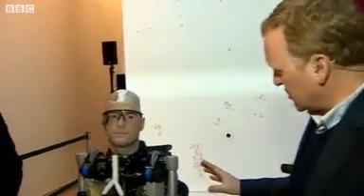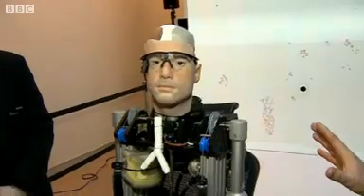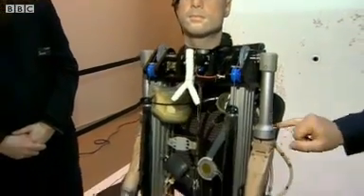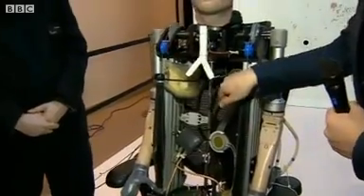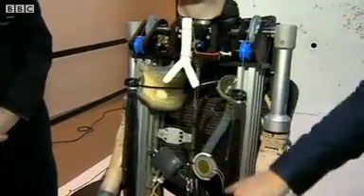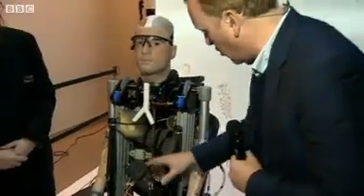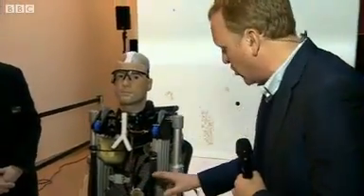Struck up quite a relationship with my friend here. The Bionic Man, as you say, build cost around about $1 million, so we reckon he's the $1 million man. You can probably hear his heart pumping away. See this artificial heart here, pumping the artificial blood all around his system. Some of these medical organs, these artificial organs actually are used. Some of them are going through clinical trials.